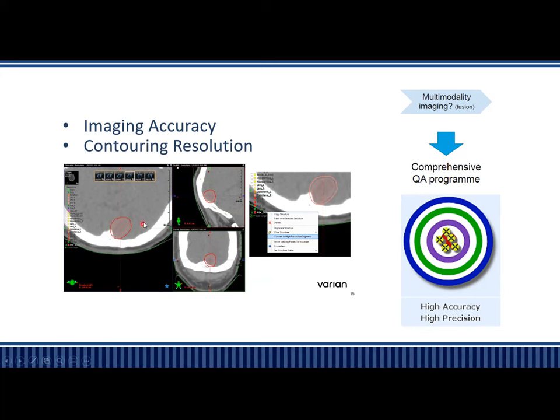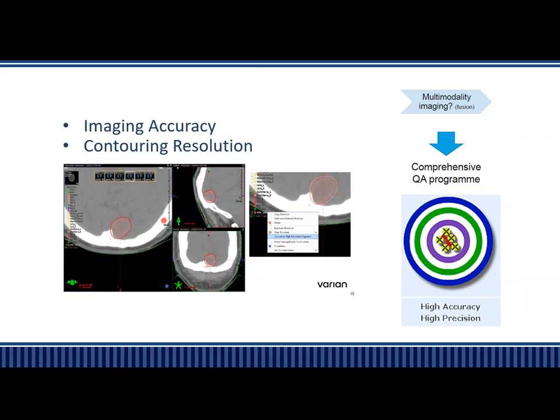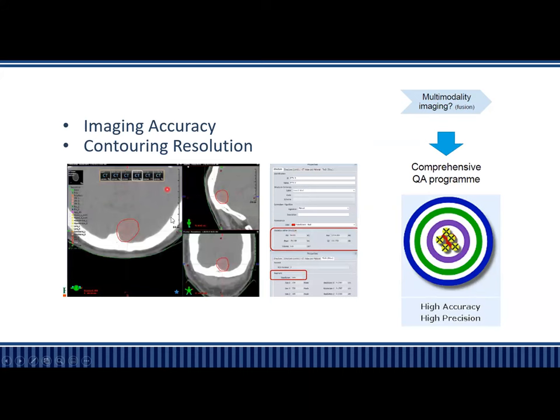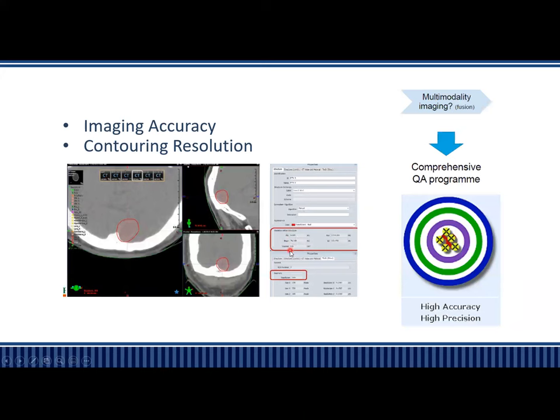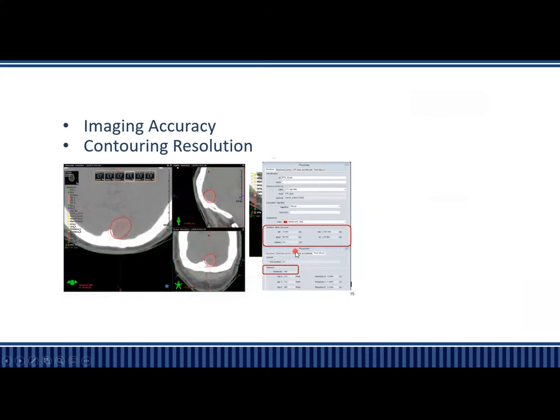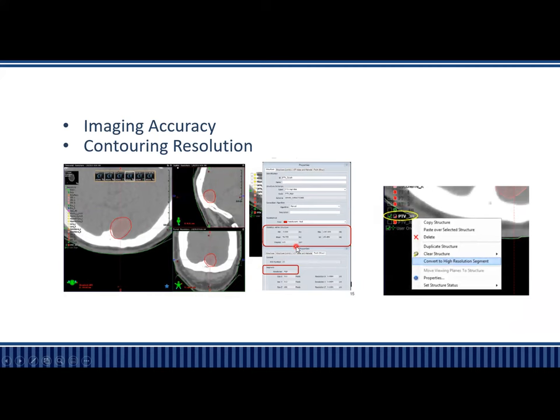Once we have a contour or are making a contour, we must make it in a high-resolution segment because the volumes are way too small compared to conventional treatment. Minor changes in the volume in different slices may cause large variation. Whatever the volume is — like CTV — we take a margin and convert those volumes to high-resolution segments. At low resolution, the volume is around 4.6 cm³, whereas in high resolution we have 4.5 cm³.